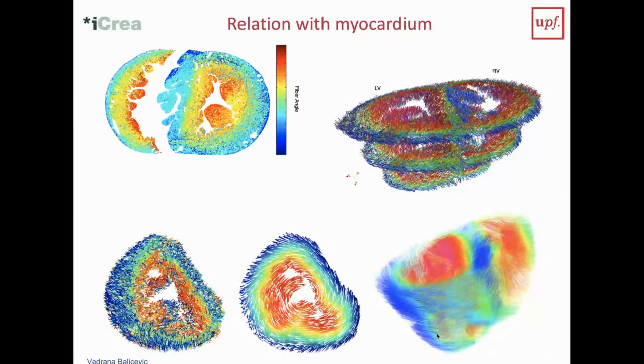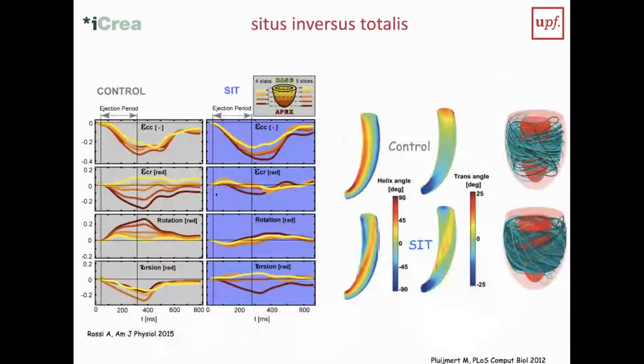With image processing, we can locally detect directions of structure. We can calculate what we call the structure tensor based on gray values, where we look at how the contrast is changing. From this, we can extract fiber orientations and then quantify this.